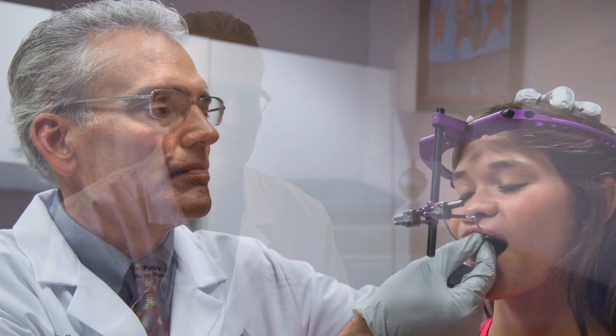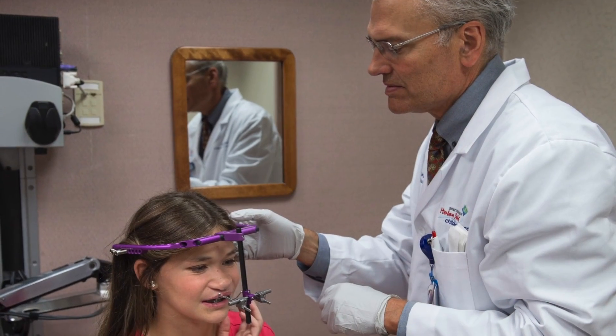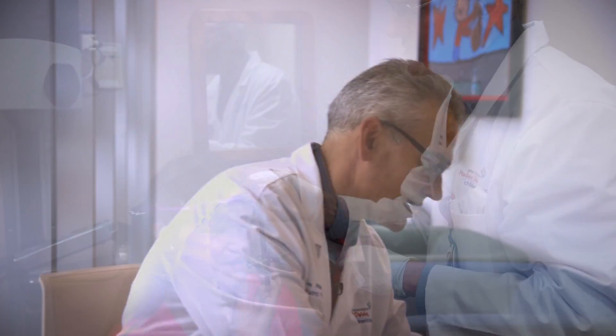The other type of distraction that we use, particularly for the upper face, the mid-face, the upper jaw, and the orbits, is what we call an external device, and I'll show you that right now.